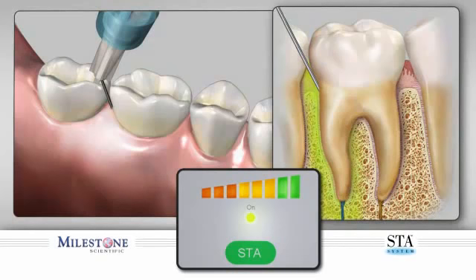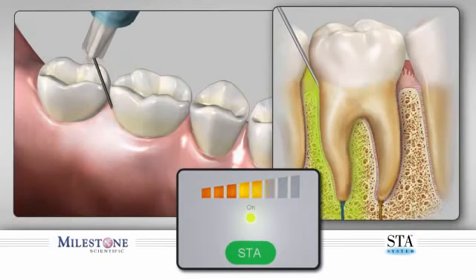The STA system also provides audible pressure feedback with a series of 3 ascending tones, indicating that the system is detecting the pressure at the needle tip. After 20 to 30 seconds with the needle located in the correct location, you'll hear the STA system announce PDL, PDL. This will be followed by a series of 2 longer beeps, indicating that the proper pressure is being maintained and that you have identified the correct needle position for that injection.